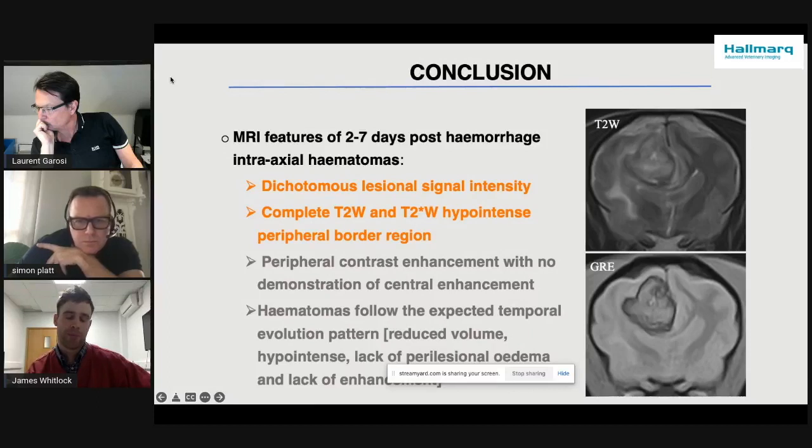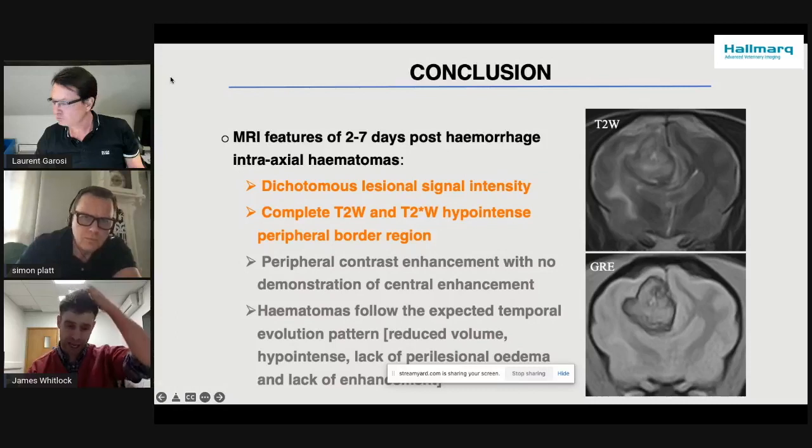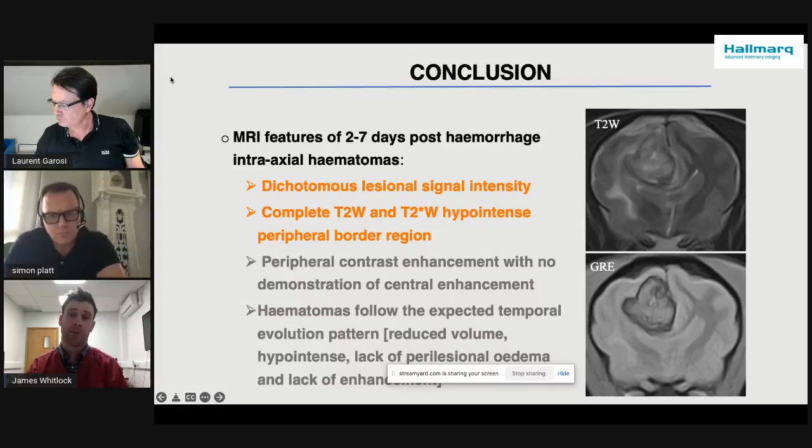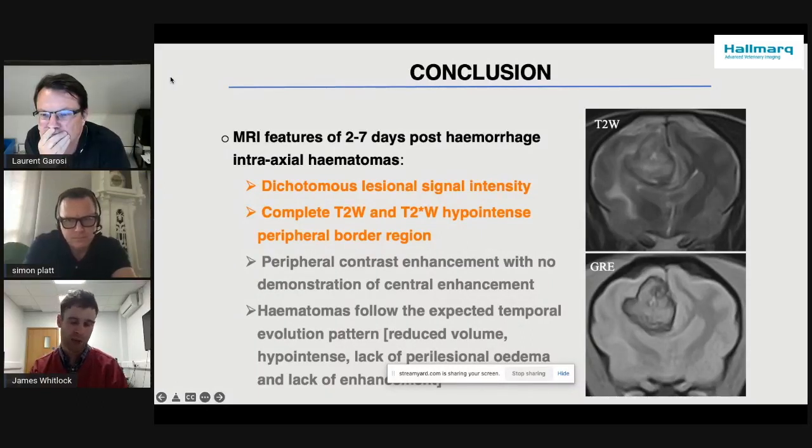We see different signal intensity patterns between the peripheral border and the central regions, because we've got two different blood breakdown products predominating in those regions. And the reason we see this difference is because at the blood tissue interface, at the periphery of the hematoma lesion, we see a far faster evolution of blood breakdown products. What they've shown in both humans and in mouse models is that more chronic breakdown products, or traditionally thought of as more chronic breakdown products, are present at the periphery of the lesion within the acute phases of bleeding. So in mice, they've seen that within 24 hours, within that hyperacute stage, we see hemosiderin and ferritin at the periphery of the lesion, due to that faster evolution.